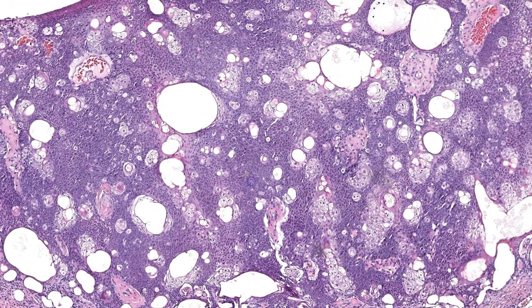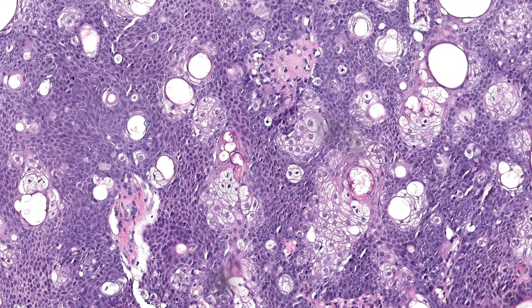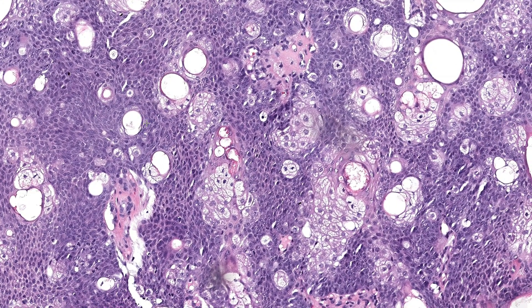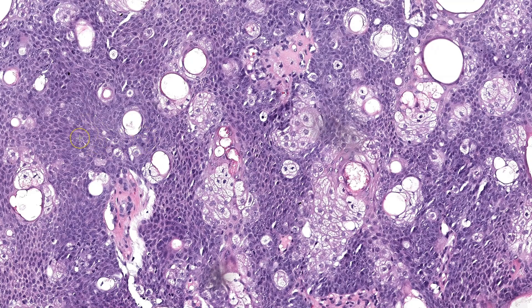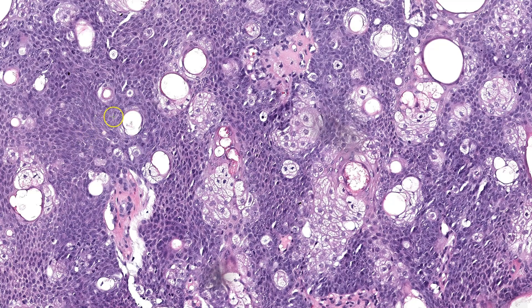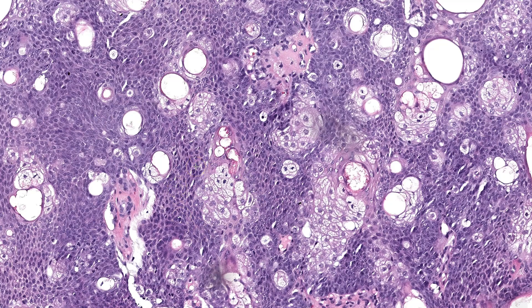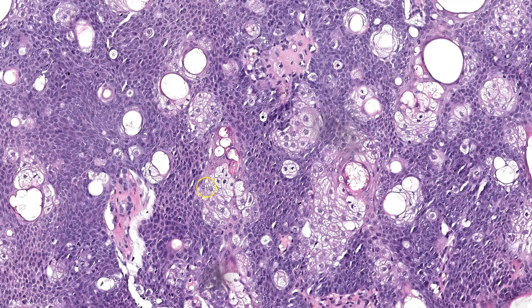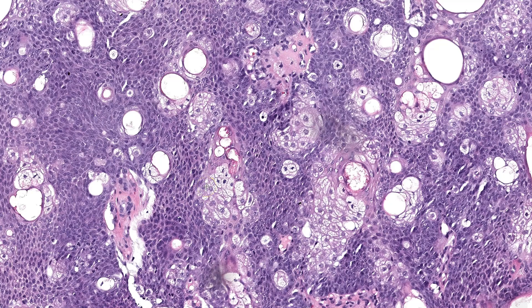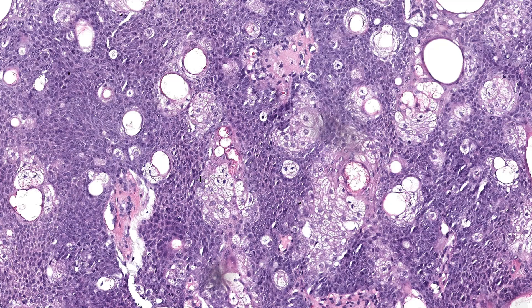Moving to higher magnification, I can see that this lesion is composed predominantly of blue basaloid cells. However, there is also a population of larger cells with vacuolated cytoplasm. These vacuoles are well defined and appear to indent or scallop the nucleus. So this is an example of a sebacioma, a benign sebaceous neoplasm composed of more than 50% basaloid cells.